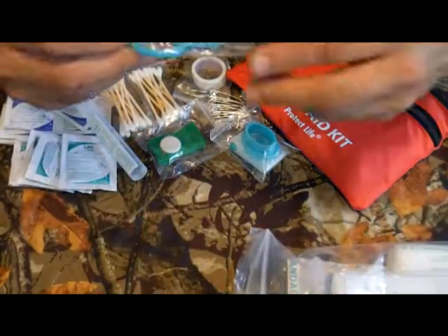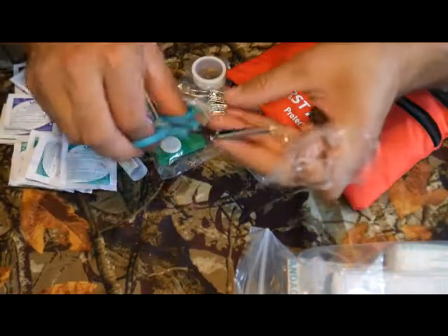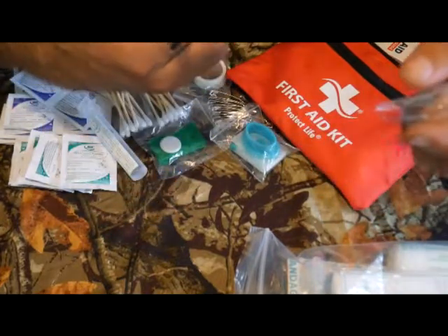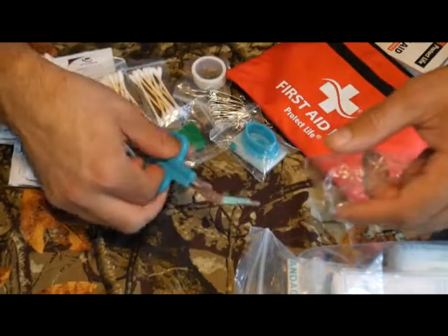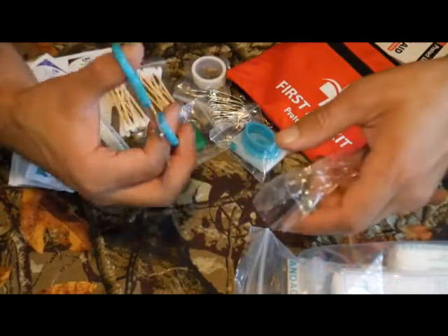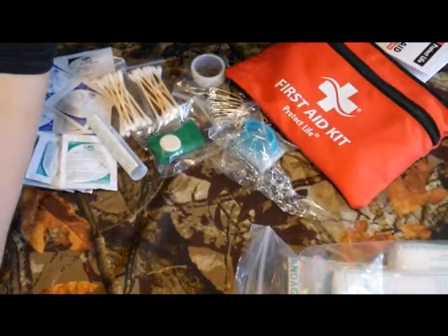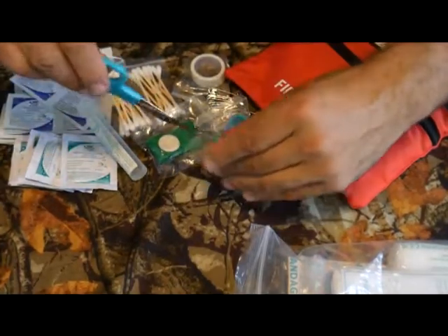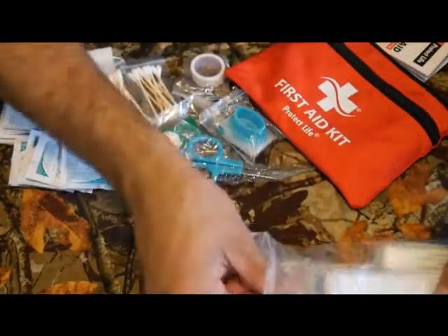They have the normal scissors — I usually expect cheap junky scissors in first aid kits, but these don't feel as bad as most. Most scissors in these kits feel very loose and can't cut anything. I tested these on an envelope just to see, and they actually cut it, which is surprising. So maybe they're not as cheap as I thought.